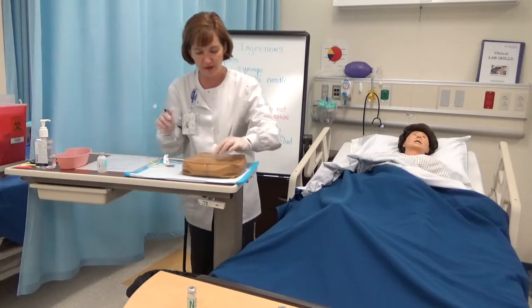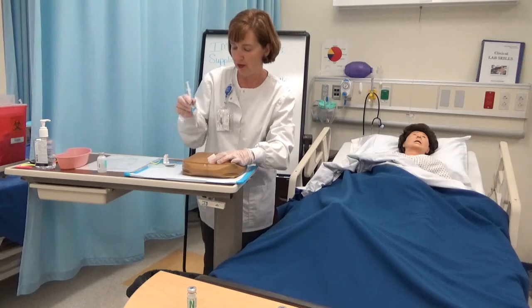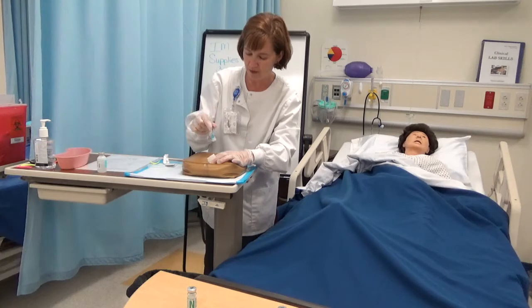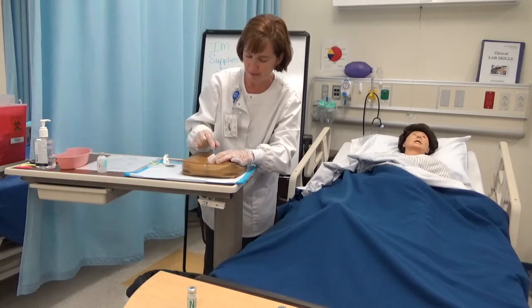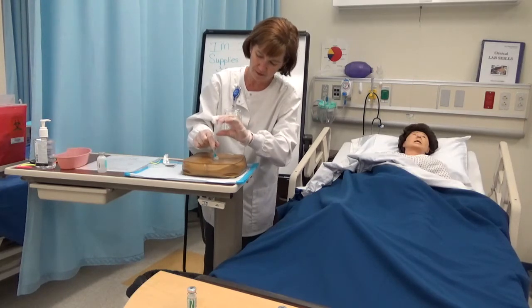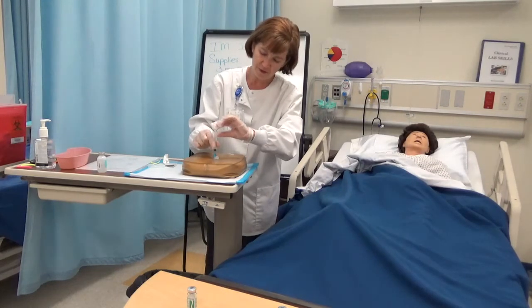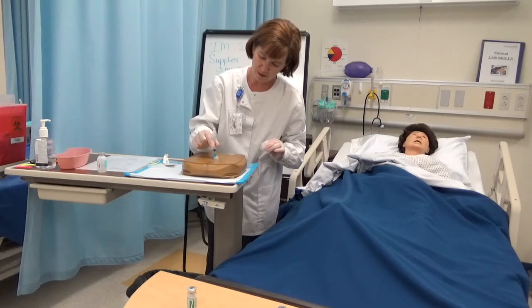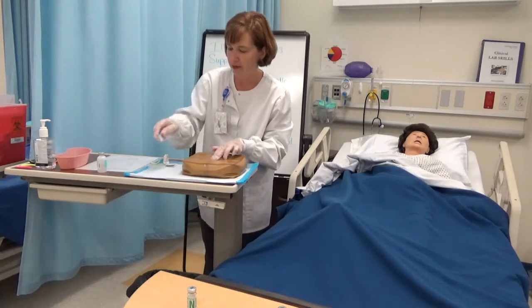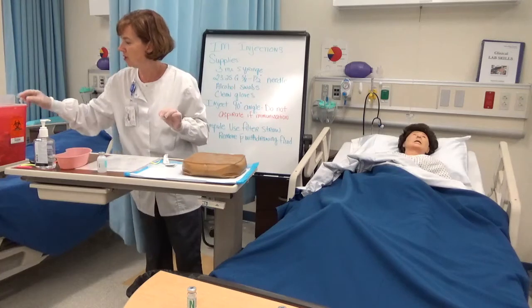Miss Cross, we're going to get ready to give that injection. It's going to feel like a quick poke. I'm going to hold my syringe like a dart. Straight in. I'm going to aspirate — I don't see any blood. Push my med in slow and steady. Hold it for a few seconds. Straight out. A little wipe. Activate your needle safety. It's going to go in the sharps.